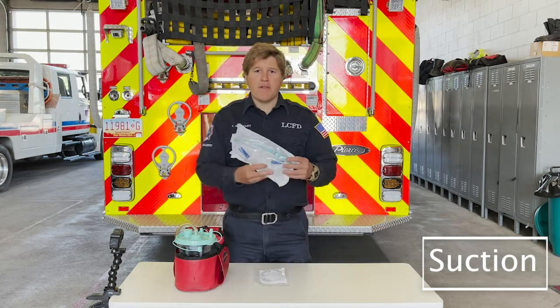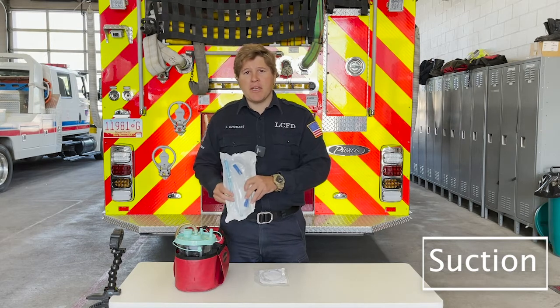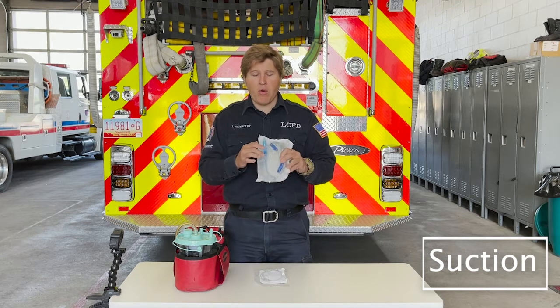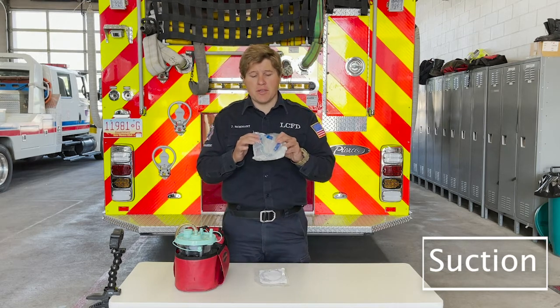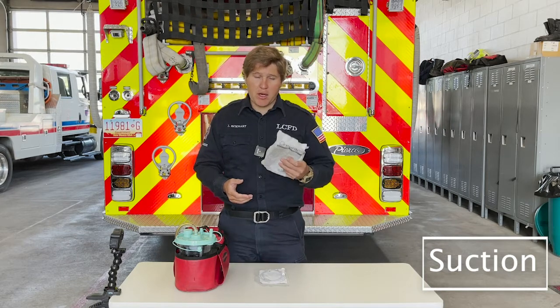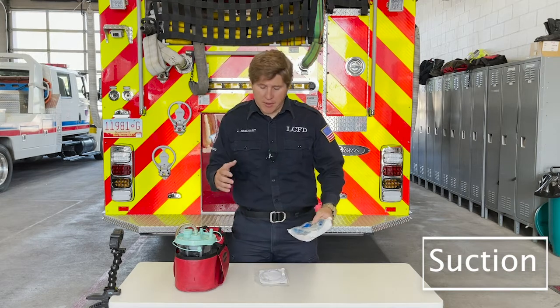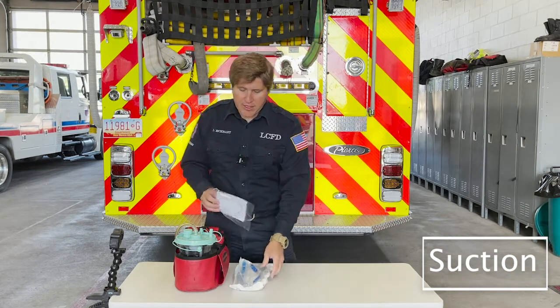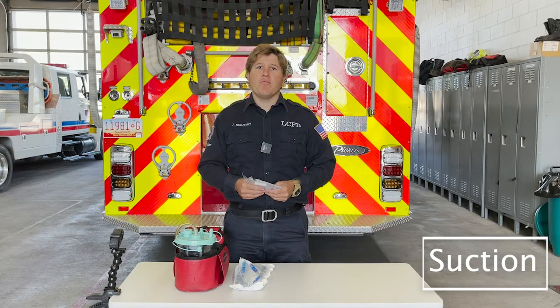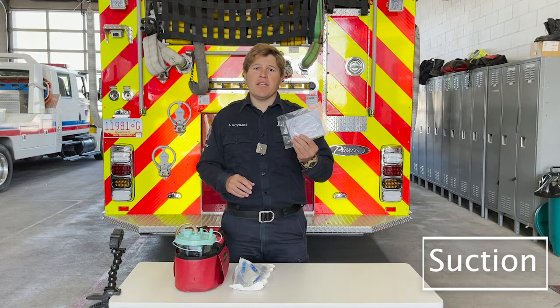Then you have your extension tubing and your Yankers. This is the same as the suction unit. We need to know this inside and out. We need to know where the hole is to cover it so we can actually perform suction. We need to know which side goes onto what and how to hook this up. That's not only for paramedics, but also basics and intermediates. This should be something that everyone knows. Another thing that I like to pull out, rather than waiting for the moment to happen, is a suction catheter for our ET tubes.